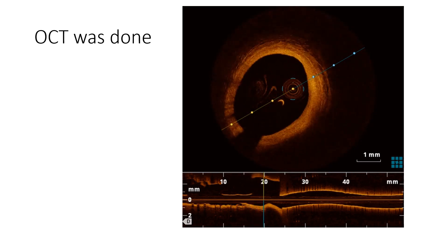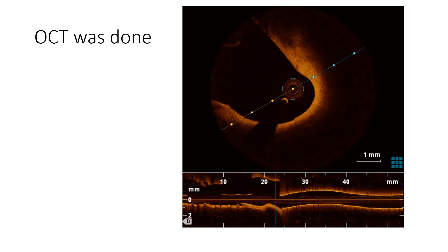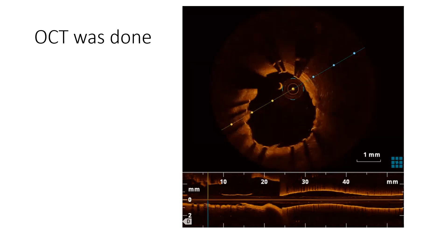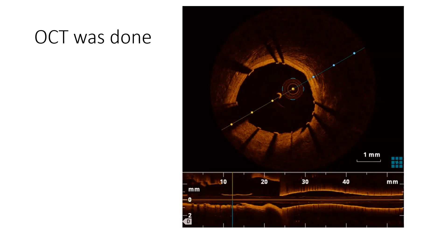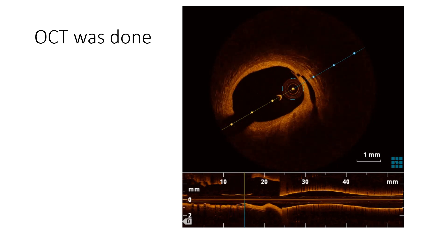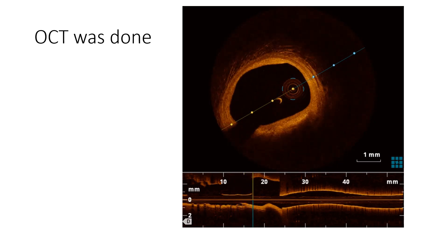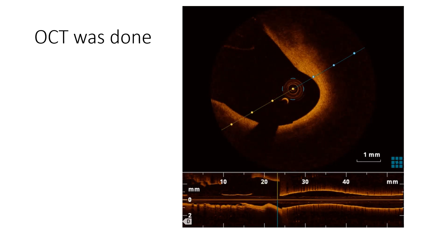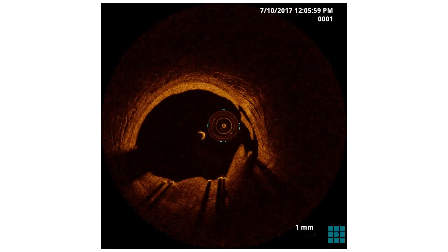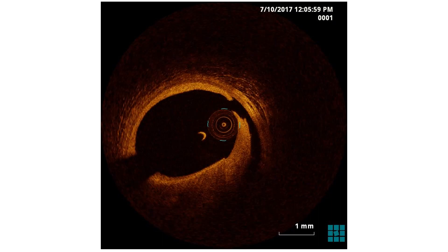The stent is well apposed and there is some minor plaque protrusion. At the proximal edge of the stent, we can see a flap of dissection in the area of the plaque extending about 8 mm. The ostium of the LAD is free of dissection, as well as the left main stem. Here is a still picture view — we can see a few struts of the stent and the beginning of the flap of dissection. Here is the extension of the dissection flap.